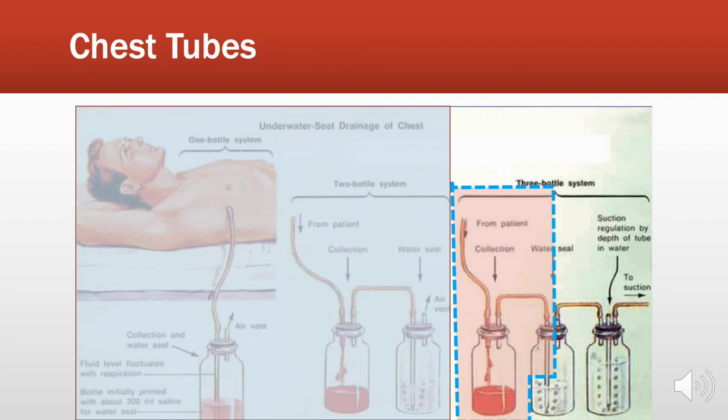So your job is to go back and check all the tubing. It's unlikely that your Pleurovac system will have a crack in it. Is it possible? Maybe. But you have to inspect the entire tubing, inspect the tube, get a chest x-ray, and figure out if it's coming from the patient or from one of our devices.